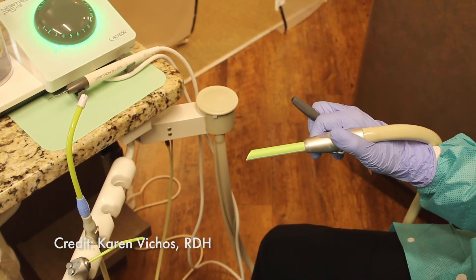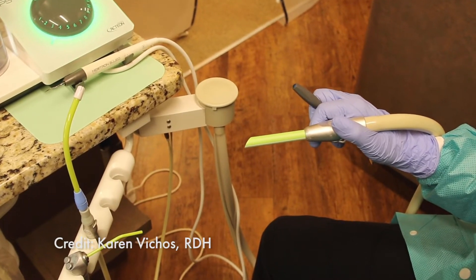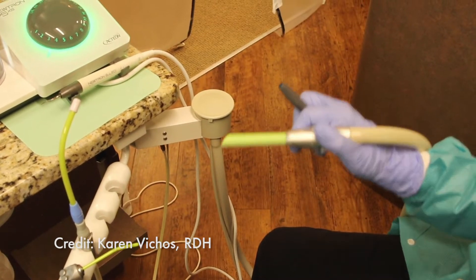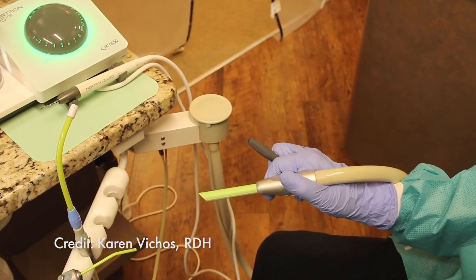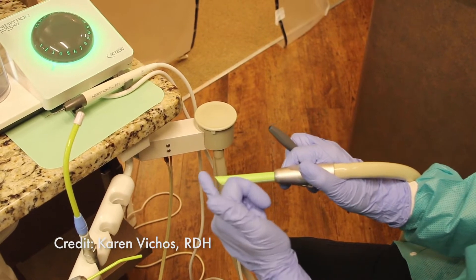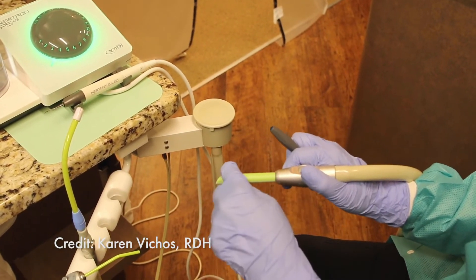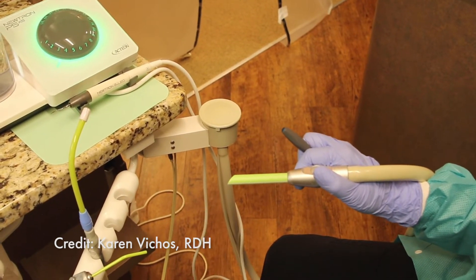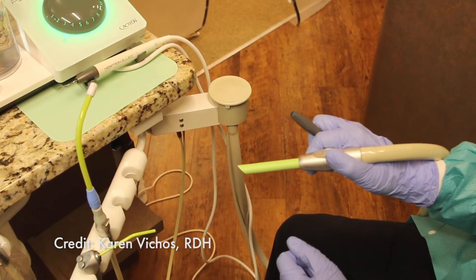I like to use the 3.5 inch HVE tip, and when I use it in a patient's mouth I make sure the back end of the tip is closest to the tissue — either near the buccal, or I'll turn it depending on whether I'm working lingual, so the flatter long side is closest to the tongue. I don't like the shorter side of the HVE to be near the tissue because tissue can get sucked into the HVE tip, and you don't want that. So I like to keep it away from the tissues.